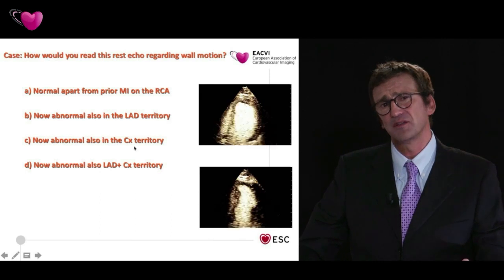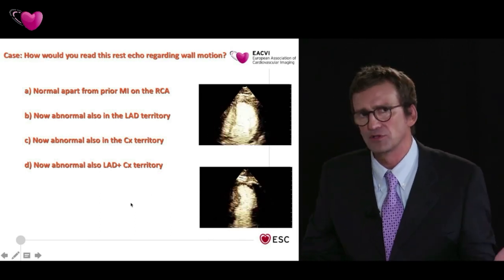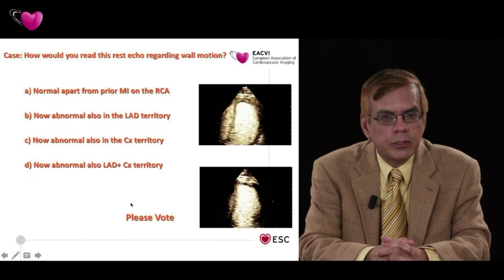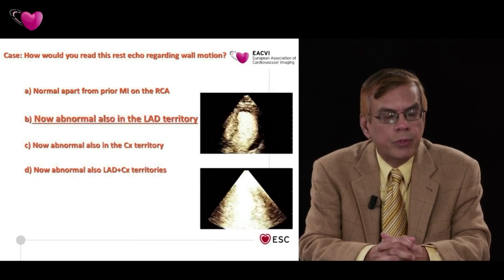And that's the reason why you need a little bit more training when you interpret perfusion than for wall motion. There's no question. For every technique you need training, whether it be MRI, SPECT, echo. You can't do things without training. And there are training guidelines, and one must follow that.